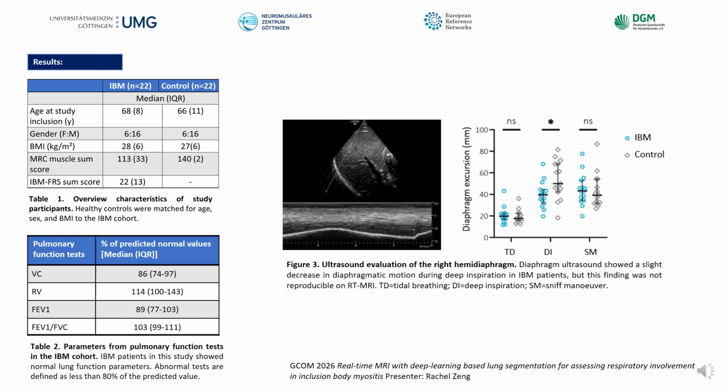All patients also underwent a sniff maneuver where they have to quickly inhale through the nose. This is a known maneuver which recruits additional diaphragmatic efforts and can unmask early signs of diaphragmatic weakness.